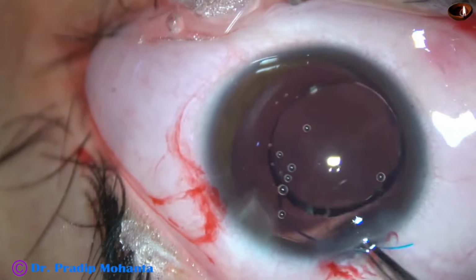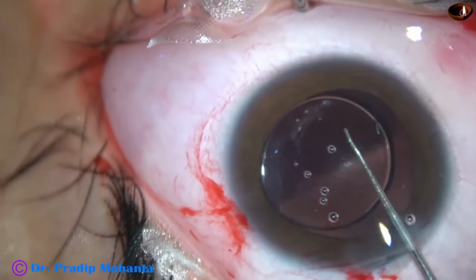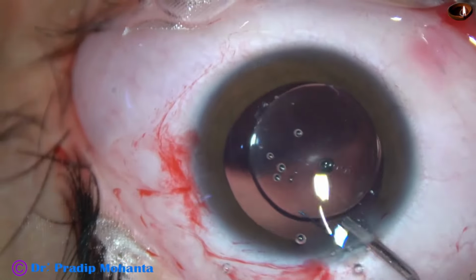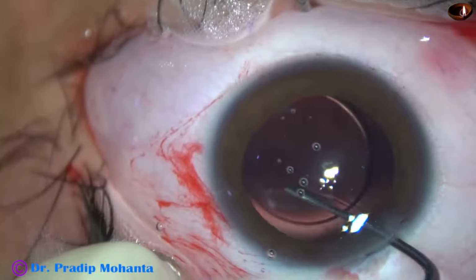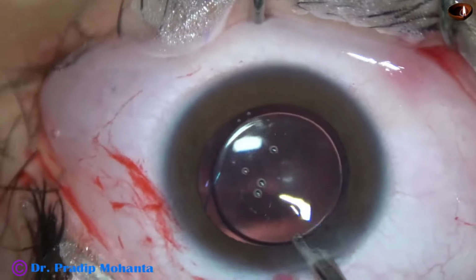And now this is the trailing haptic. It has gone over the iris. I tried to place the haptic in the bag, but it has gone on the surface. And now it is going to be difficult with the side port. If I had the side port on the right side, it would have been easier. When I use the main wound with a Sinskey hook, you can place the haptic-optic junction posteriorly in a much better way than with the side port, and the trailing haptic has gone into the capsular bag. And now we have to clean the viscoelastic very nicely.